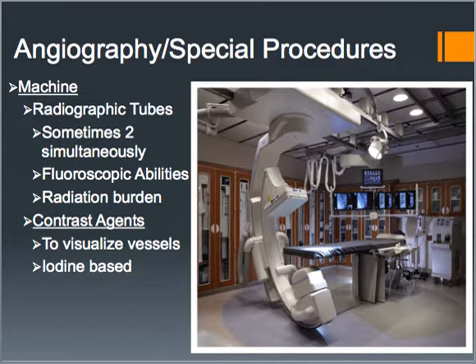What the procedure is kind of like is the patient will have to undress, they'll have to remove all their clothing, jewelry, put on a gown, and then the patient lies flat on this table. Now, the positions might be different. It's going to depend on what they're trying to visualize. If it's their legs, their head's going to go down at this end, their leg's going to go down here. If we're looking at their heart or their carotid artery or the brain, the blood vessels in the brain, their head's going to go down at this end. We can move the machine more frequently, but we want to center the area of interest closer to the end of the table where the machine is at.